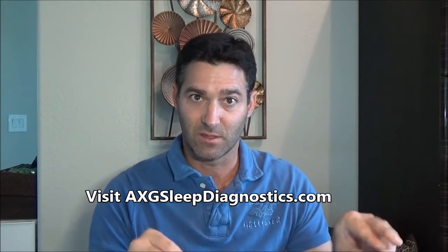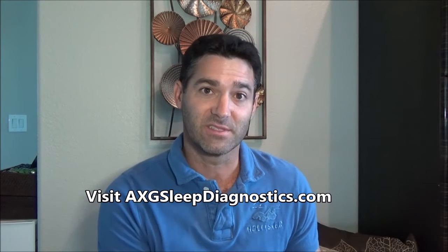When these guys get the study back from a type 3 or type 4 test, all they do is auto score it. The computer just sees these differences in the breathing airflow line and says, oh, apnea, hypopnea, apnea, hypopnea. It just does that automatically. No one's looking at it, no one's analyzing it. Next thing you know, your doctor gets that report back and it says you have severe sleep apnea or moderate sleep apnea. Or even worst case scenario, maybe you were awake all night, just lying there breathing normally the entire night because you have all this gear on you and you can't sleep.